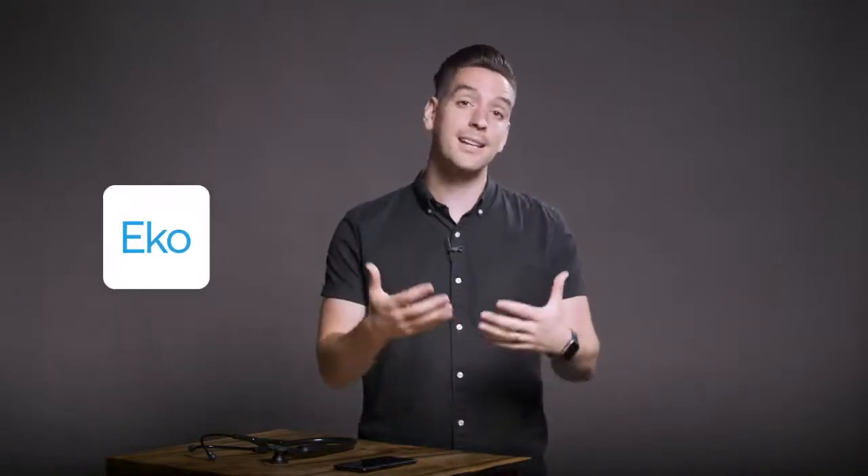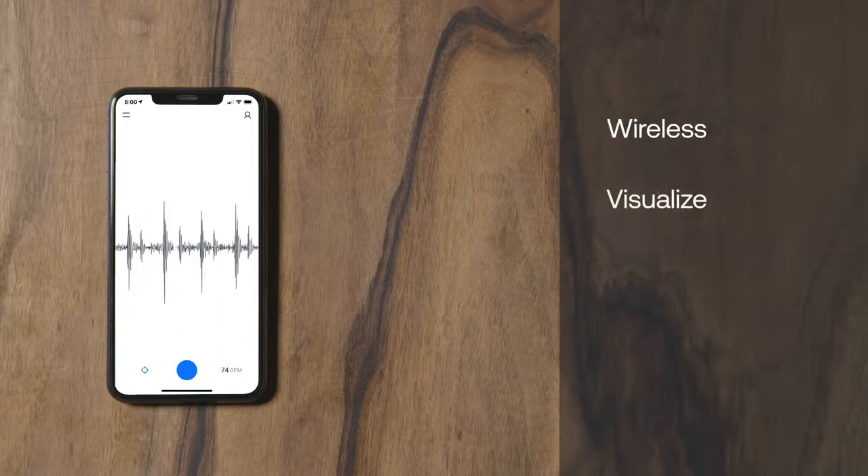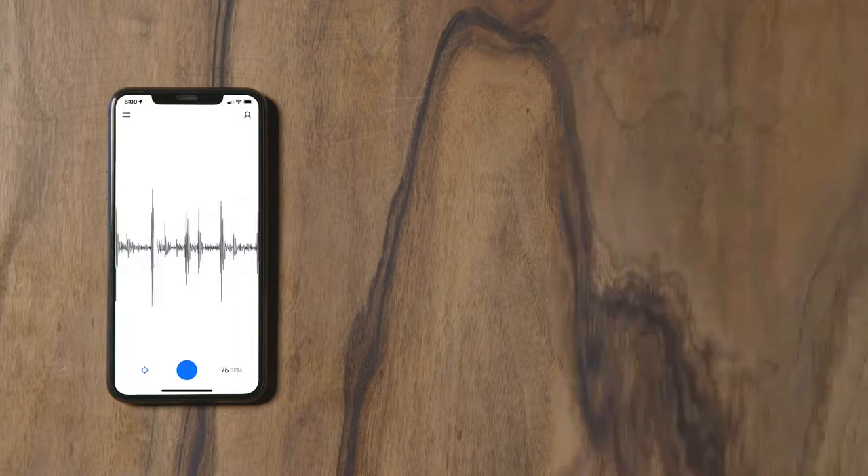To unlock the full potential of your stethoscope, download the Eko app and pair your stethoscope with our connected platform. The Eko platform allows you to auscultate wirelessly using the Eko app and headphones, visualize heart and lung sound waveforms, save recordings for future reference, and share them with a colleague for a second opinion.